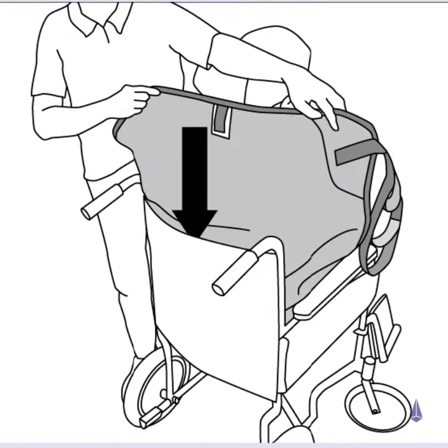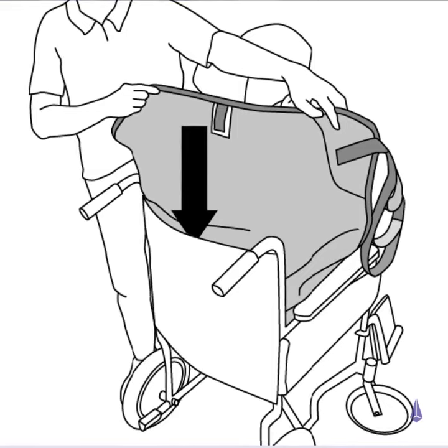With the sling label facing outwards, slide the sling fully down the back of the patient.